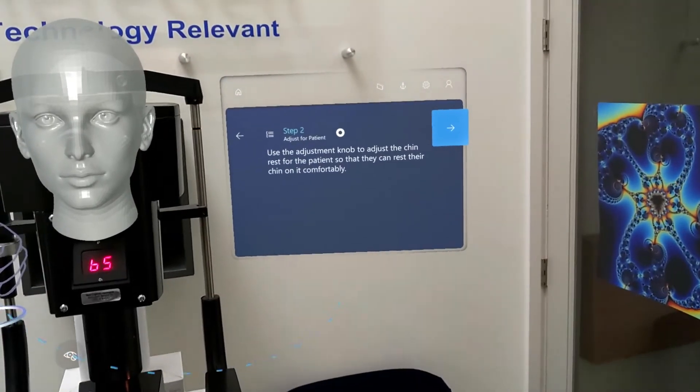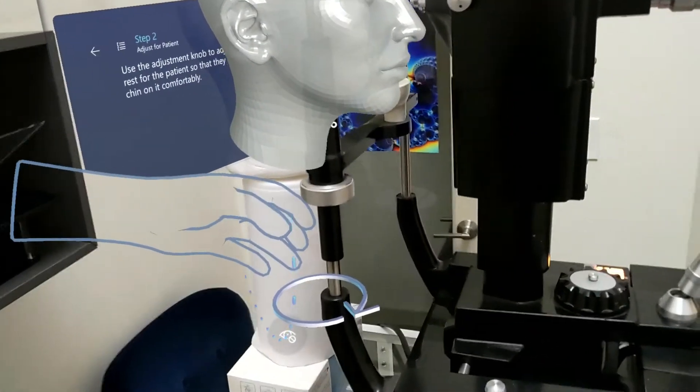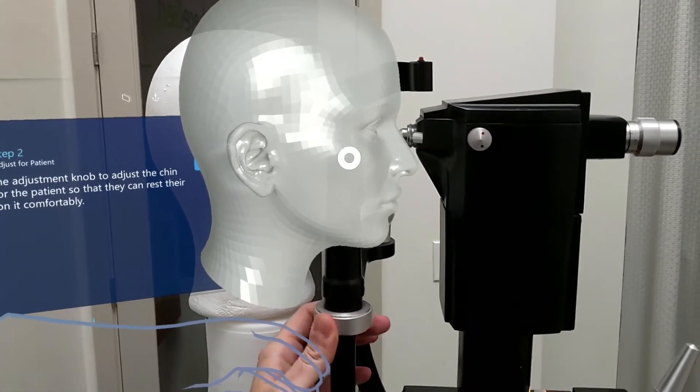Use the adjustment knob to adjust the chin rest for the patient so that they can rest their chin comfortably. Here I'm being directed to where the adjustment knob is, so we know we need to take this and raise it to the appropriate level for the patient.